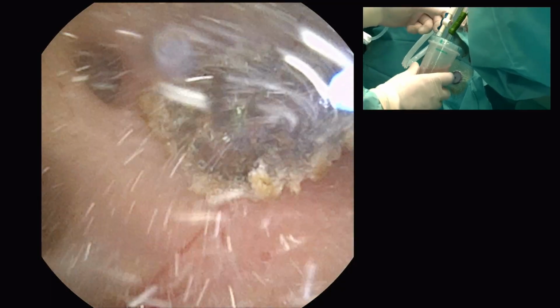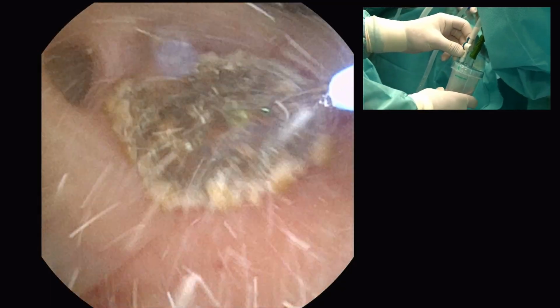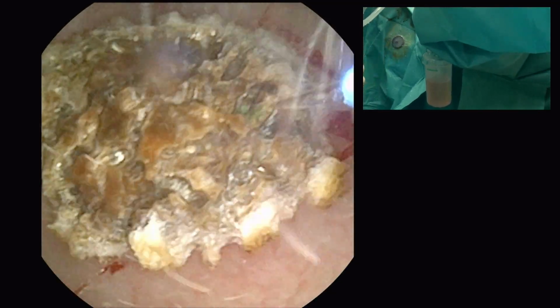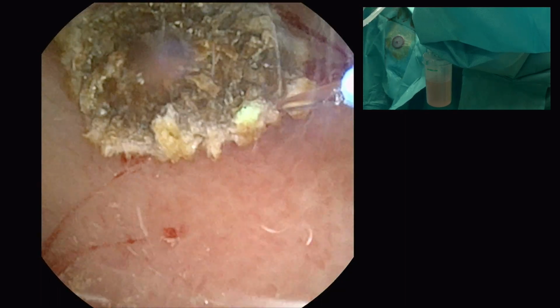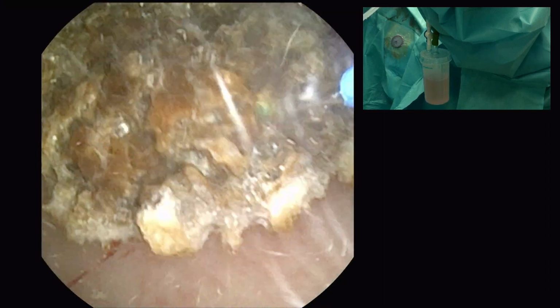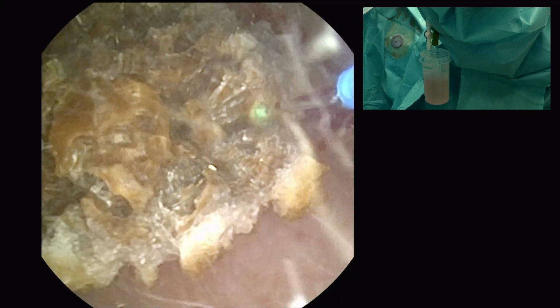Dr. Sajad, you have the privilege to use this suction sheath. It's not freely available in the market, and everybody cannot afford it, especially in the private sector. It has a price of 13,500. But we have the luxury of having a golden card, so we can use it for the patient's benefit.